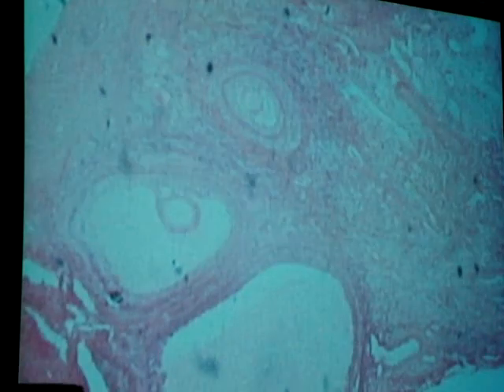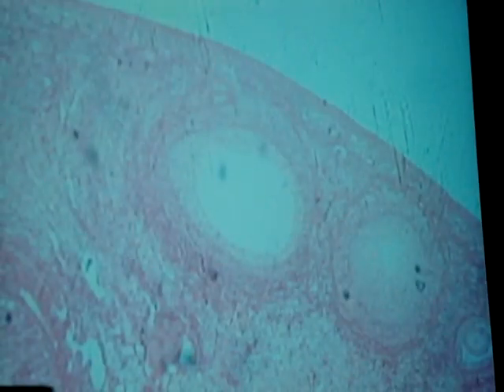Okay, so here's the big picture of the ovary. So you have just all this massive stuff. So it really doesn't, again, look like anything else. It's all by itself. Okay, so there's three major things you're going to find in here: the primordial follicles, the Graafian follicle, and then the corpus luteum.